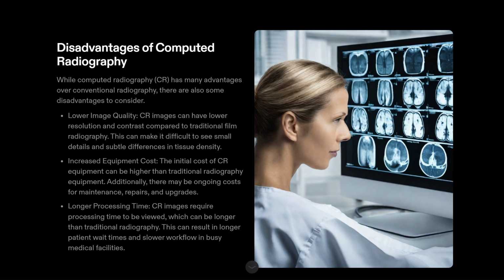Next, we are going to see about the disadvantages of this. While there are many advantages over conventional radiography, there are also some disadvantages of computer radiography we have to consider. Lower image quality. Computer radiography has lower resolution and contrast compared to traditional film radiography, which makes it difficult to see small details and differences in tissue density.